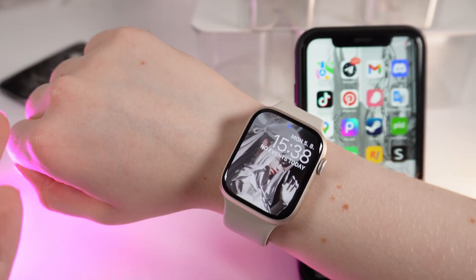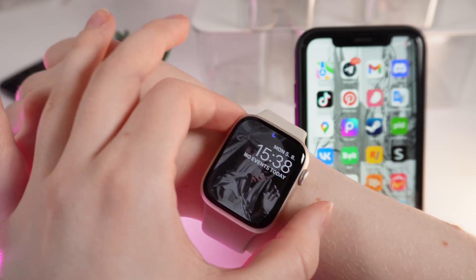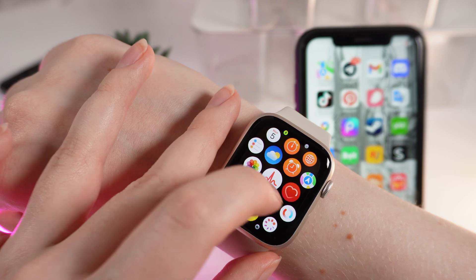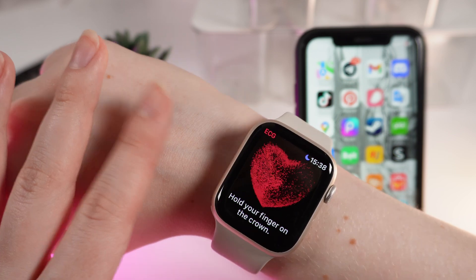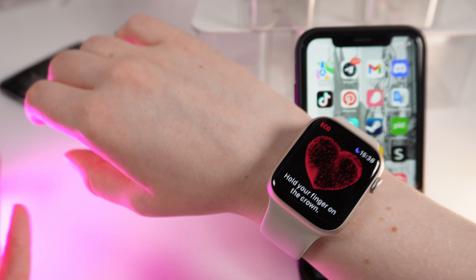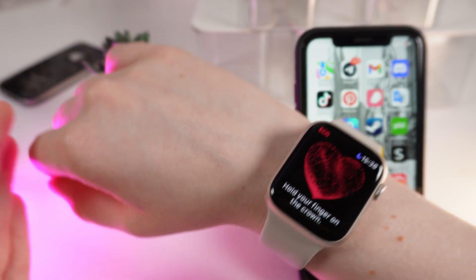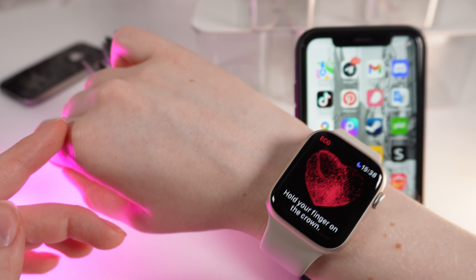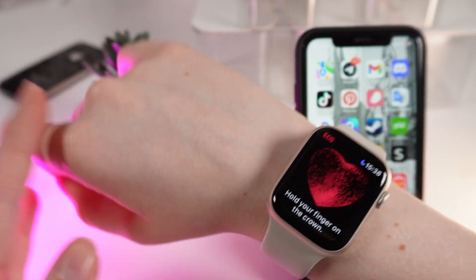Now let's record an ECG together. Click on the digital crown to open the applications and scroll down until you see the ECG app. Click on it and right here you'll get a lot of warnings and messages, and you would need to set up your date of birth. It will also open an application on your phone so you can read more about the ECG.